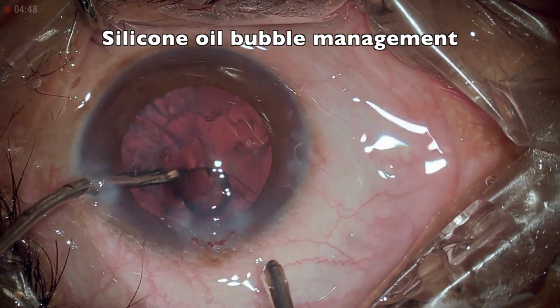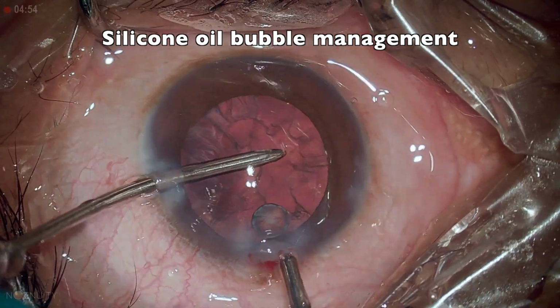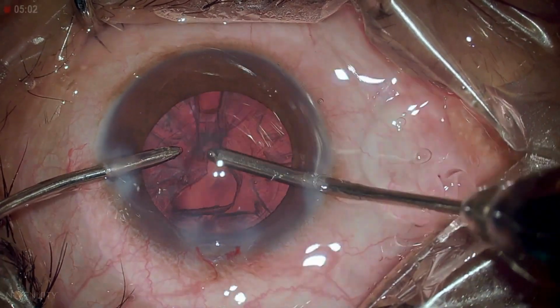So what we did was we cut off the oil because it's like a dumbbell. So you remove it at the attachment part where the pedicle is, and the oil settles back inside the chamber.